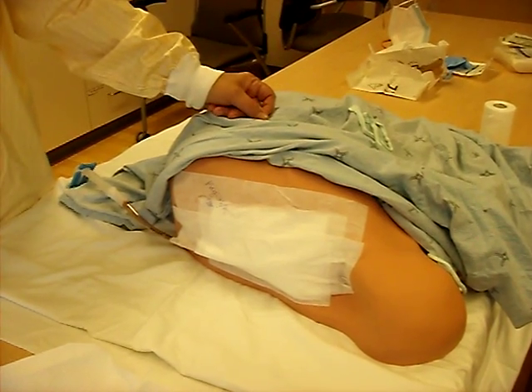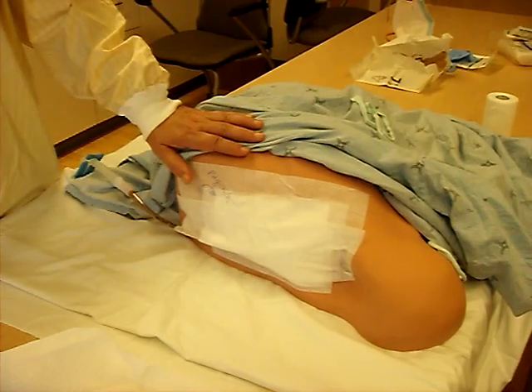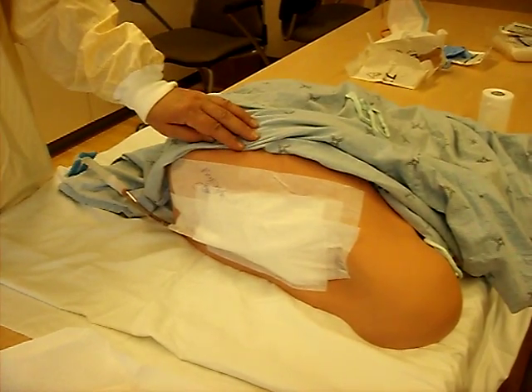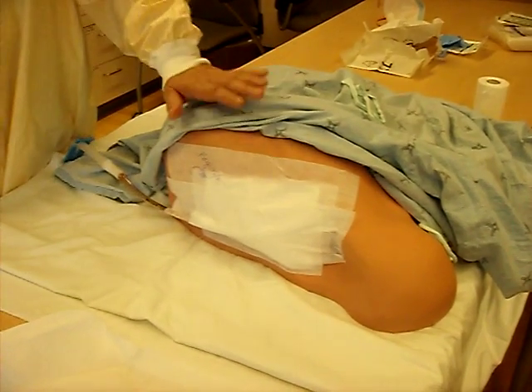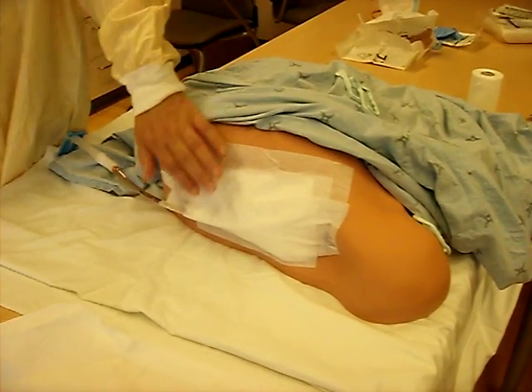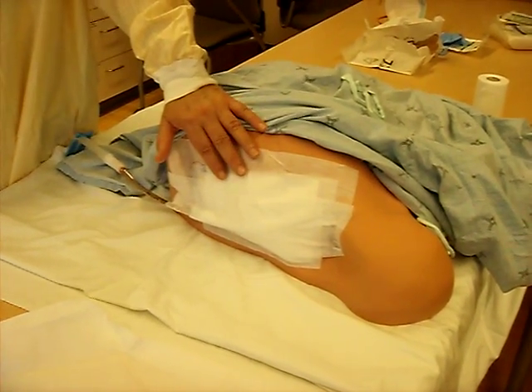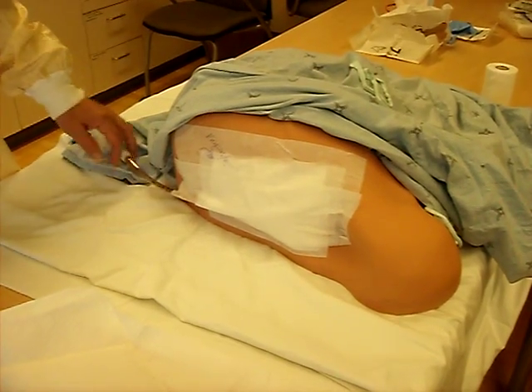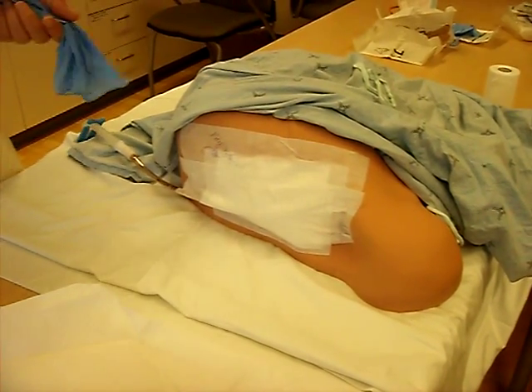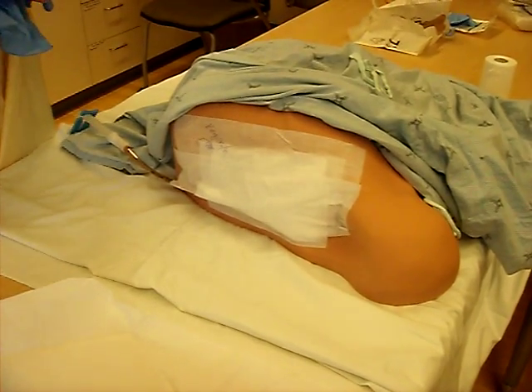Today we're going to talk about removing a standard issue chest tube on a patient, from the beginning of the procedure, and also some of the other things that need to be done. So you have a patient with a chest tube who's likely had either an effusion or another problem, a pneumothorax, where the chest cavity needs to be evacuated of fluid and air. Now the problem has resolved itself and the physician has requested that you remove the chest tube.